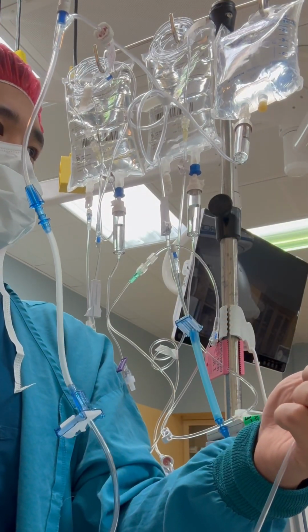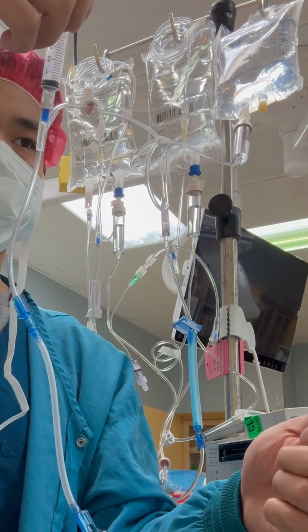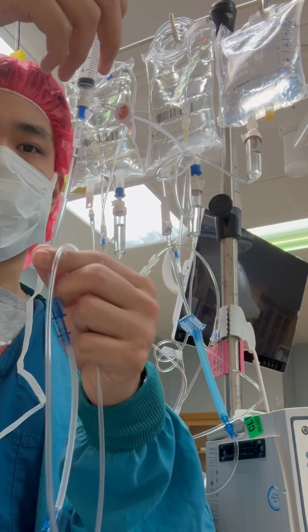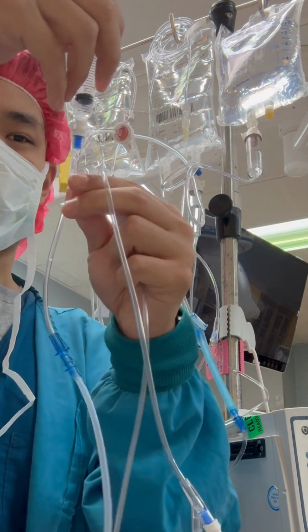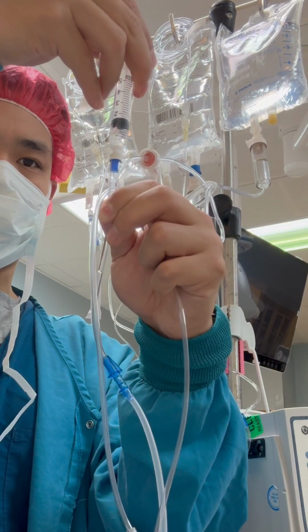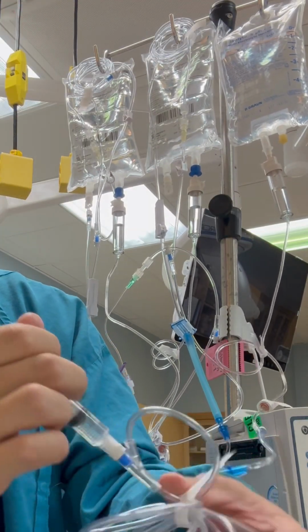I unclamp and wait until the fluid passes the first chamber, clamp, and then I aspirate all the air out. Look at all that air. That's about half a cc of air right there. You can flick it, the last bit of air. There we go. You hook it up to the next chamber and repeat.